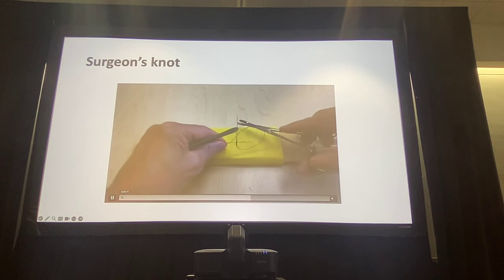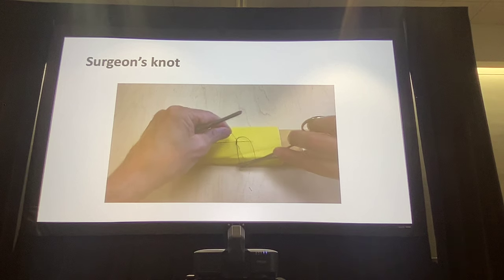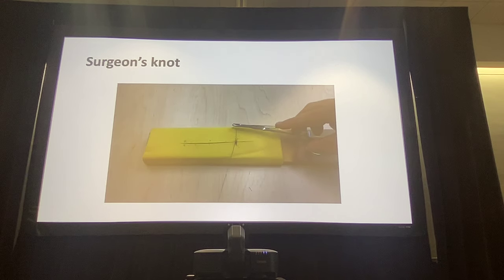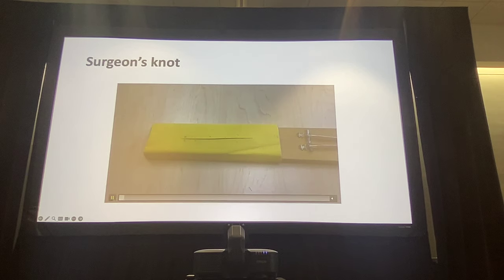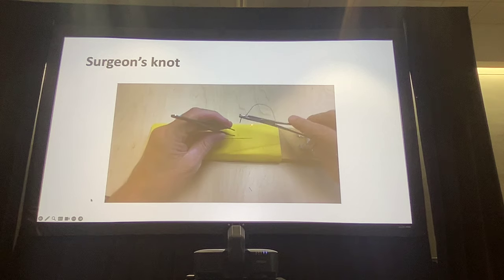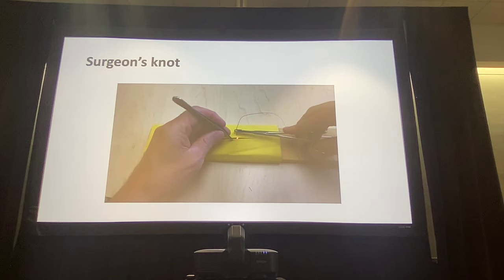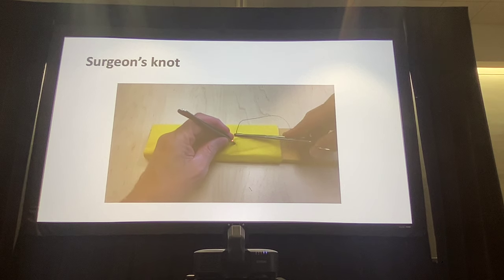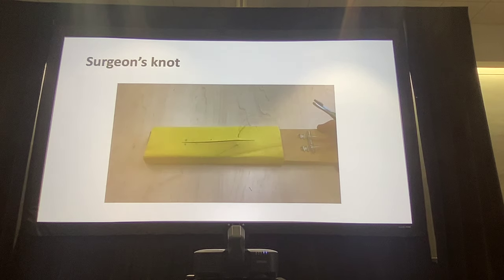And again, these aren't mandatory for today. I want you to learn the knots and the different patterns, but just keep those things in mind, and as you get more skilled at this, be aware of these details. It's going to help you in the real life situation. Let's play this again. So instead of taking one bite all the way through like he does, what I advise trying to do is take a bite and then come out the incision with your needle and then reinsert your needle back in the incision at the opposite end to come back out the skin. But again, the focus here is the knots. I just wanted to mention it for you.